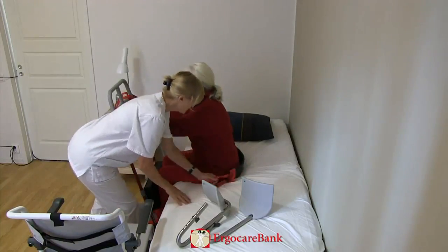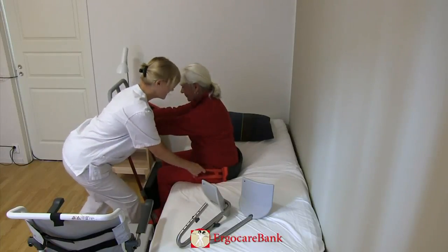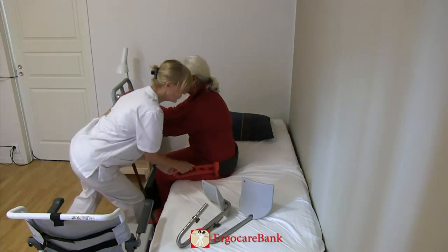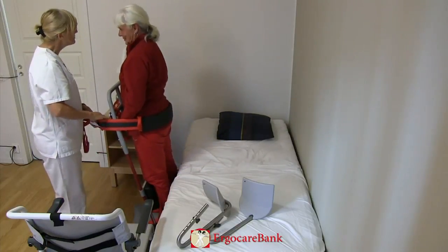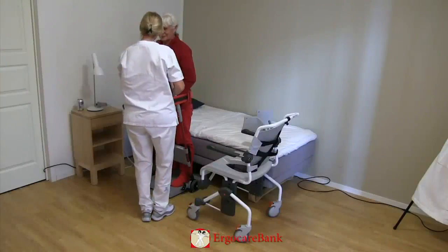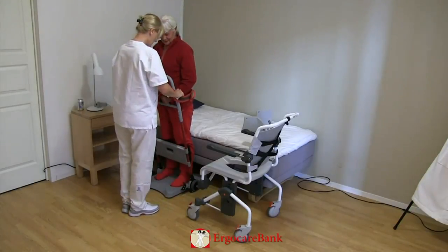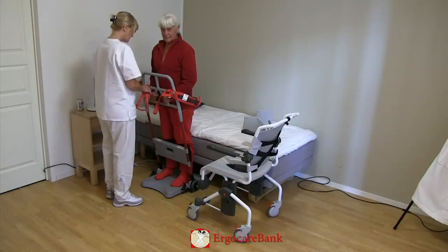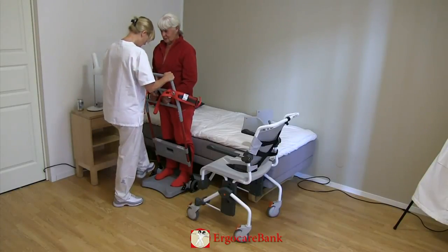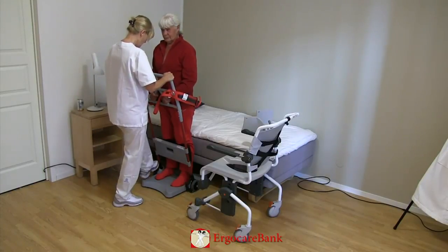The staff member prepares the transfer. Celia, on three you will stand up. One, two, three. The staff member secures the belt to the Raizer so that Celia is standing secure with her knees locked against the knee rest.